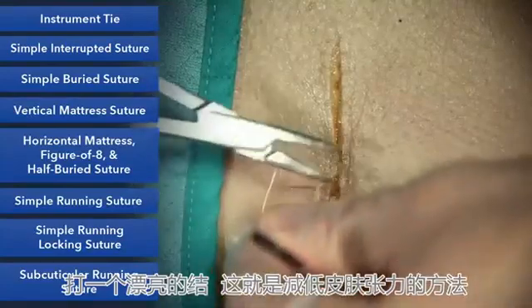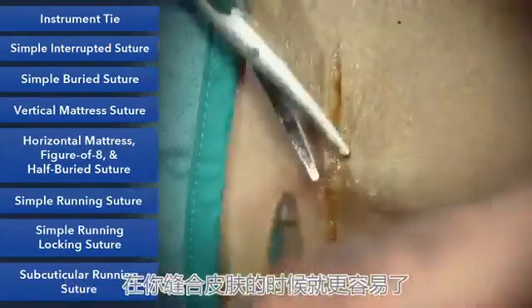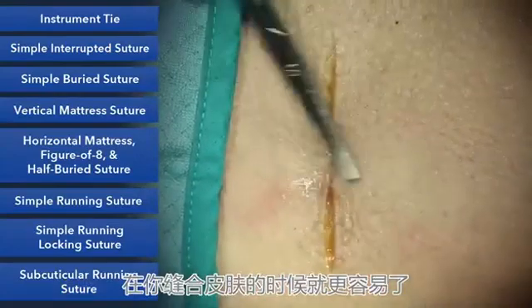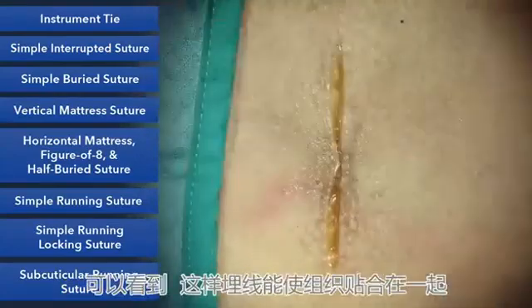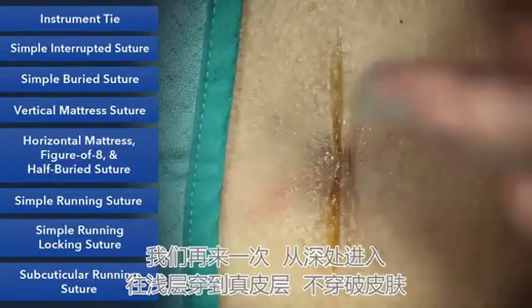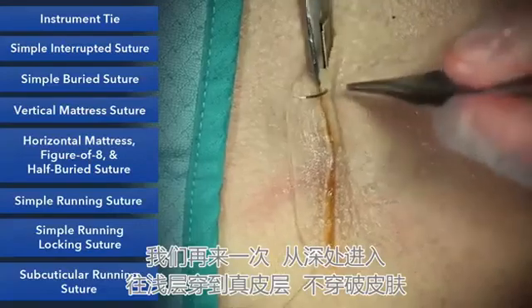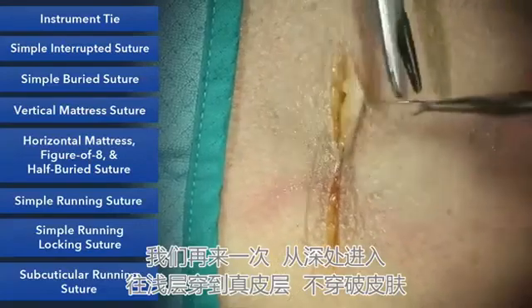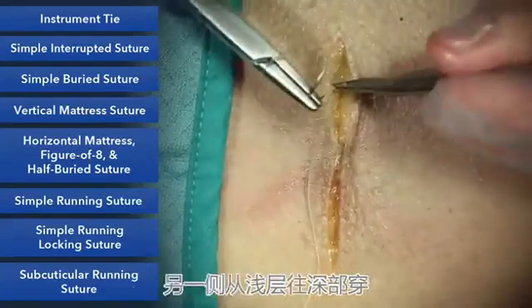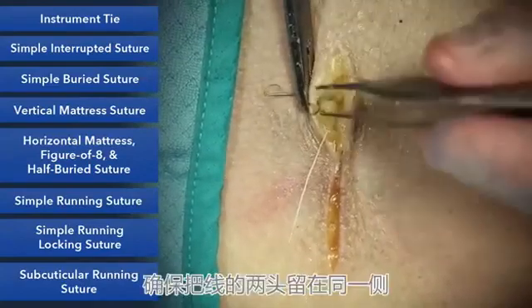And what this does is it takes the tension off the skin so that when you go to do your skin closure, you really can work on approximation. You can see here that helps hold that together. Let's go ahead and do one more. You're going to go from deep to superficial without buttonholing the skin. And then go from superficial to deep. Make sure that you're coming out on the same side of the loop.